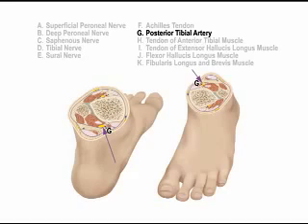If a nerve stimulator is used to identify the tibial nerve at the ankle, 5 to 7 milliliters of 0.75% or 0.5% ropivacaine or 0.5% bupivacaine can be injected on each of the 5 nerves.